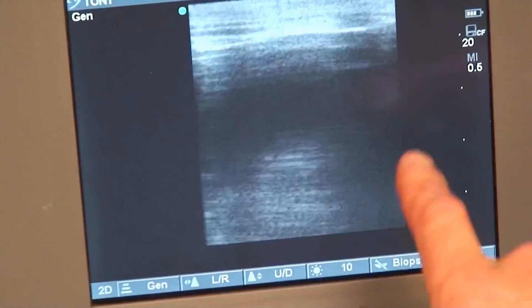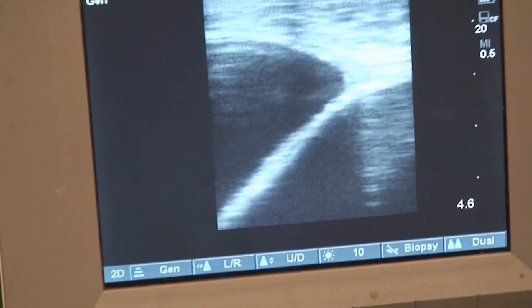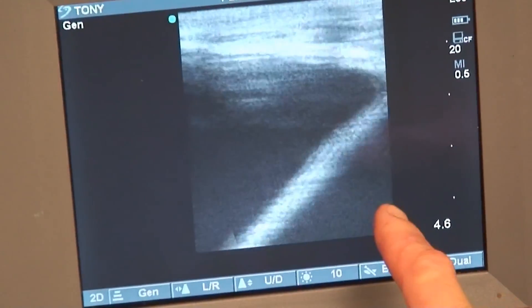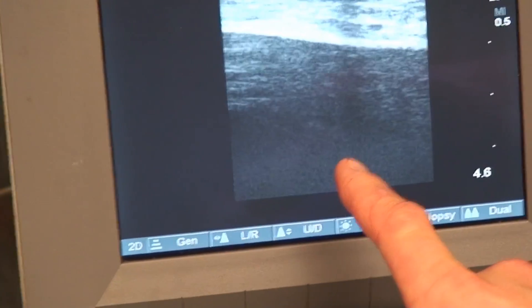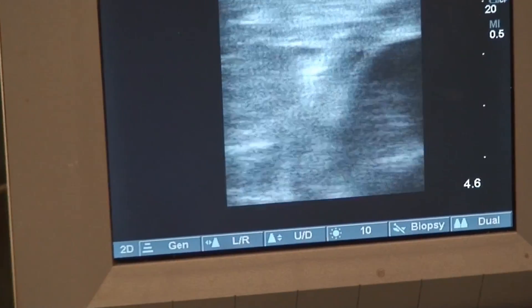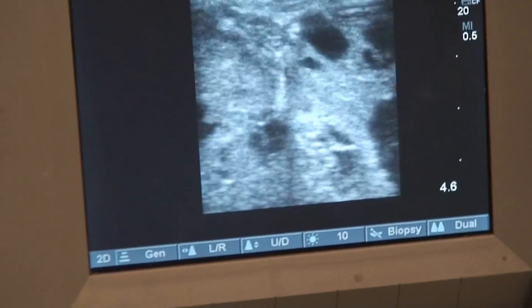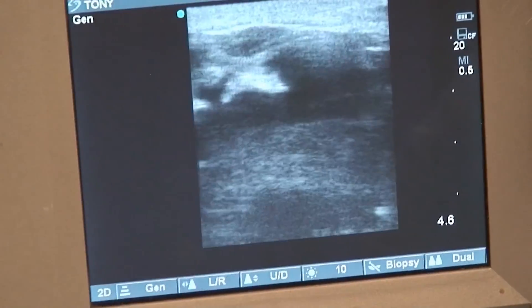You see a lot of fluid in here, it's all black. So there's a lot of liquid here. On the left side it's all black. You see it's not only one area — there's also another area, more to the back, and also more to the front. There's a lot of work to do. Big ones, small ones. The fish will be very empty after the surgery.